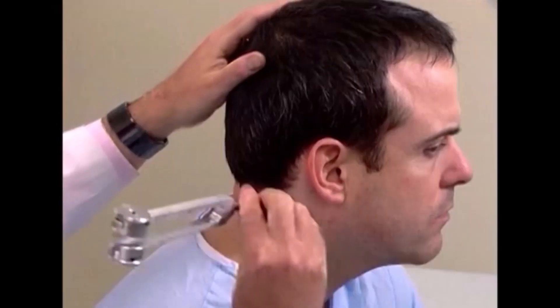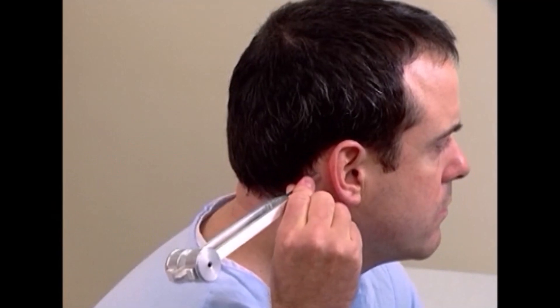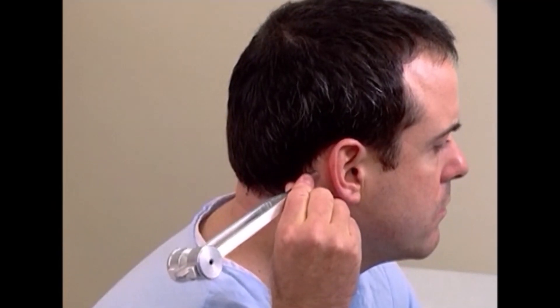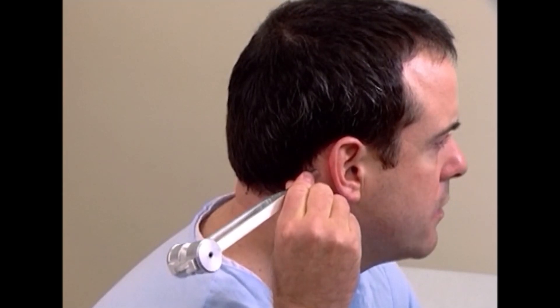I'm going to demonstrate the Rinne test first. Strike the tuning fork by placing it into oscillation by striking the heel of your hand, and then placing the vibrating tuning fork on the mastoid process of the patient. Mr. Johnson, do you hear or feel anything? Yes. Tell me when you stop hearing it or feeling it. Okay, what about now? I can hear it. So air conduction is greater than bone conduction, and that's normal.